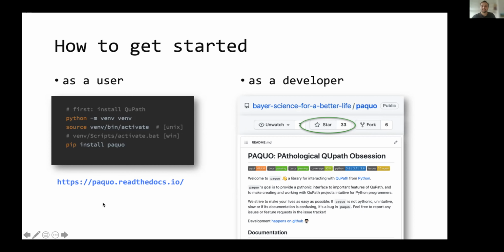So yeah, we have already one question in the chat from Andrew. He writes, "This is brilliant. I'm wondering about speed efficiency. Are there certain use cases where it wouldn't be appropriate to use, for example, millions of cells?"